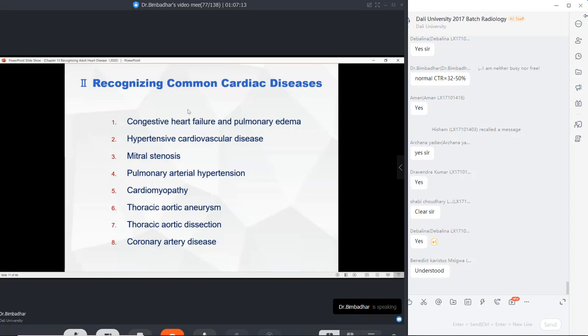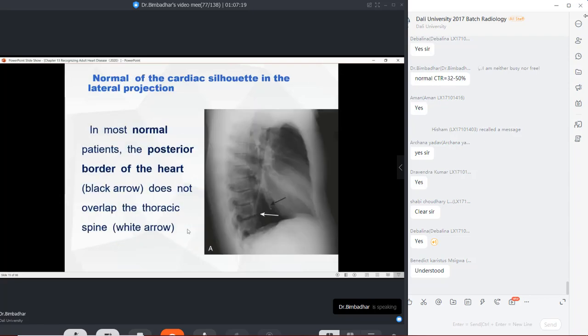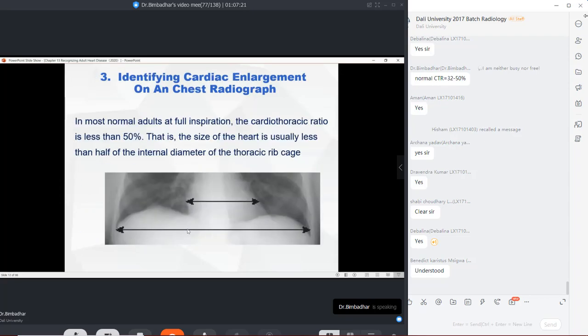This is the biggest part here, and measurement of the cardiothoracic ratio is a very important question. So remember that. I will tell you in more detail about the measurement of the cardiothoracic diameter when we are talking about particular diseases. There is a formula for that. We will talk about that one. But right now, just take a break.